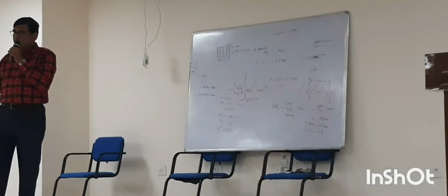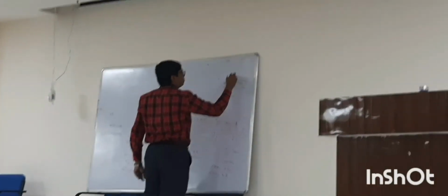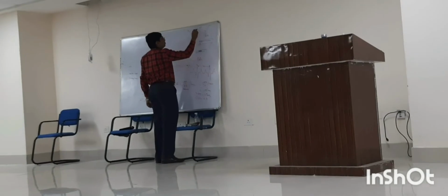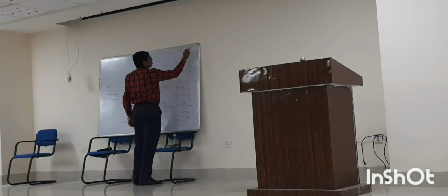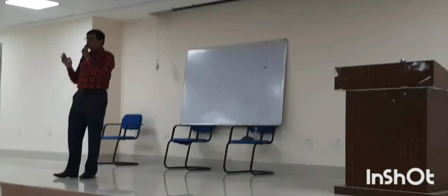So rate, rhythm, then is mean electrical axis. What is the axis? Before this, I am going to draw the waves in left oriented chest lead, right oriented chest lead and limb lead.